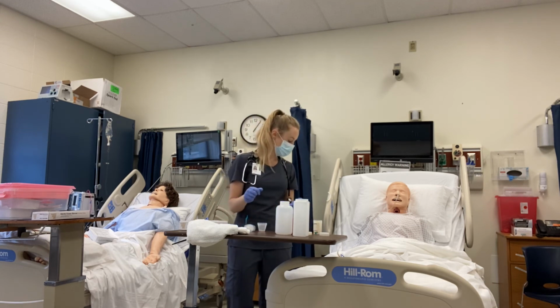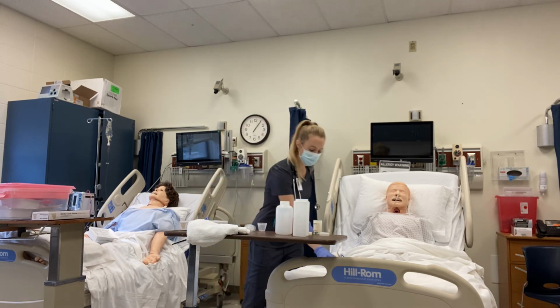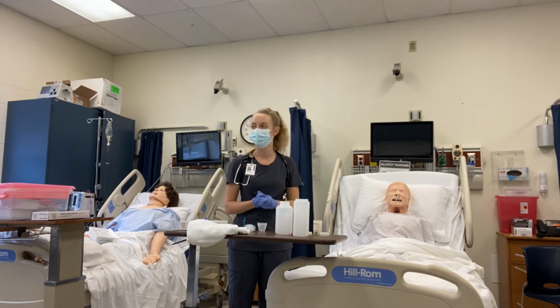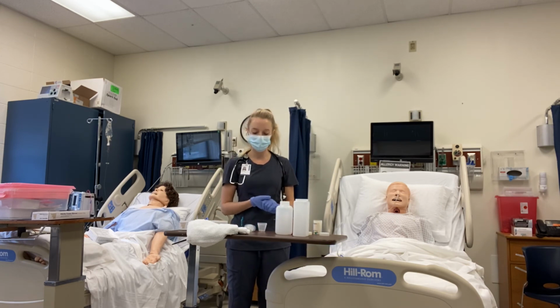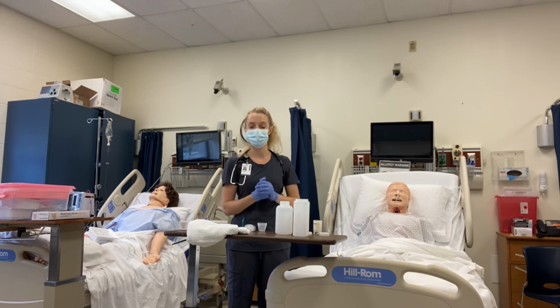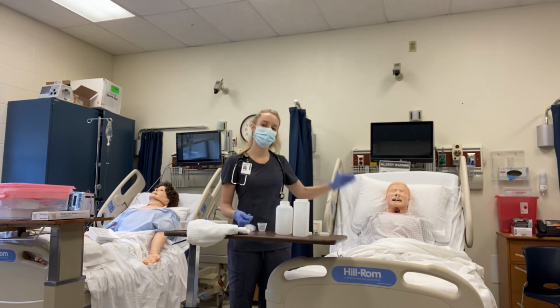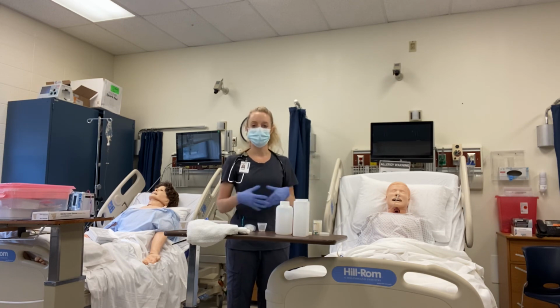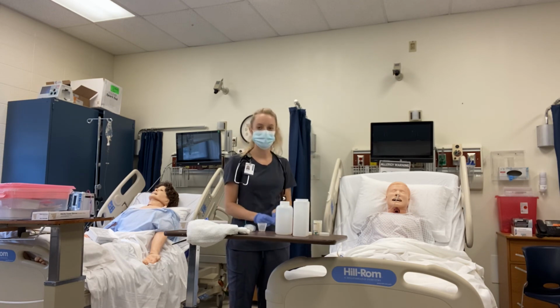Assuming that Mr. Jones is doing okay with this medication, my next step is to document the medication that I passed and to also make sure that I document the flushes through his NG tube in his intake portion so that we maintain an accurate grasp on that. I'm going to ask Mr. Jones to remain sitting for about 30 minutes after also to help everything settle in his stomach as well. And that's it. Thank you.